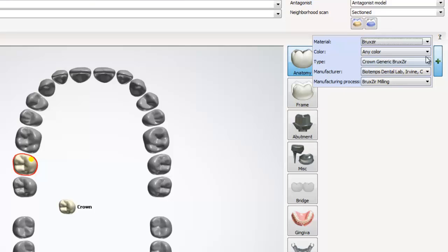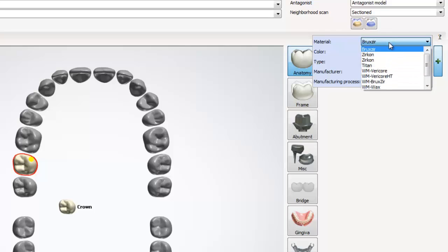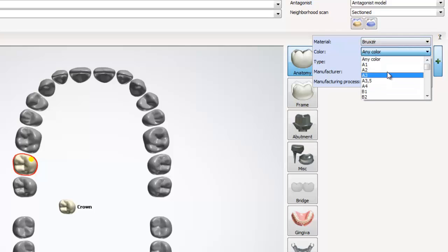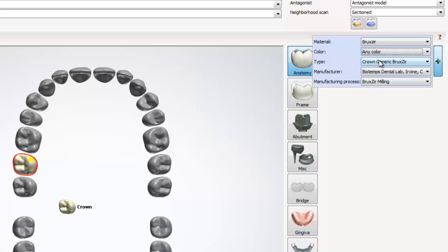The first option is the material. This is where we can choose the material we want to mill the restoration out of. The second is color. This one doesn't affect the final product. The third is type. The type is generated from the material we choose prior to this drop down.